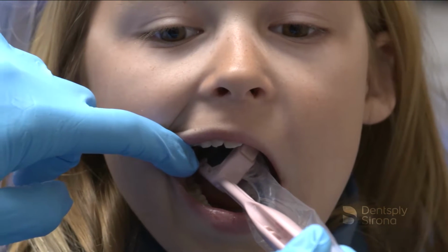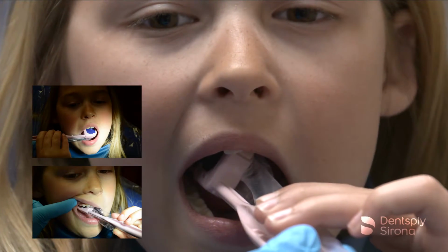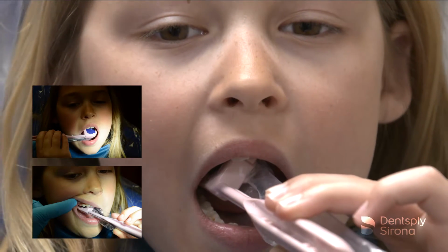Position the holder in the patient's mouth and have the patient or parent hold the ComfortWand holder in place. Align the PID and the image is ready for capture.